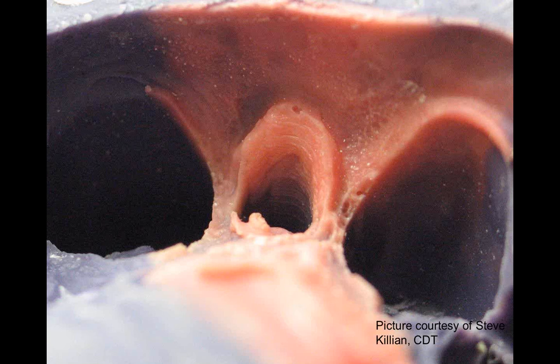All right, another little one looks pretty good. Everything seems to be okay here. We do have that little bubble there that's on the marginal area again. I'm a little concerned about whatever this is right here. Most doctors don't create protrusions and shelves, especially on the buccal surfaces, facial surface of their stuff. So that might be something we want to take a look at.